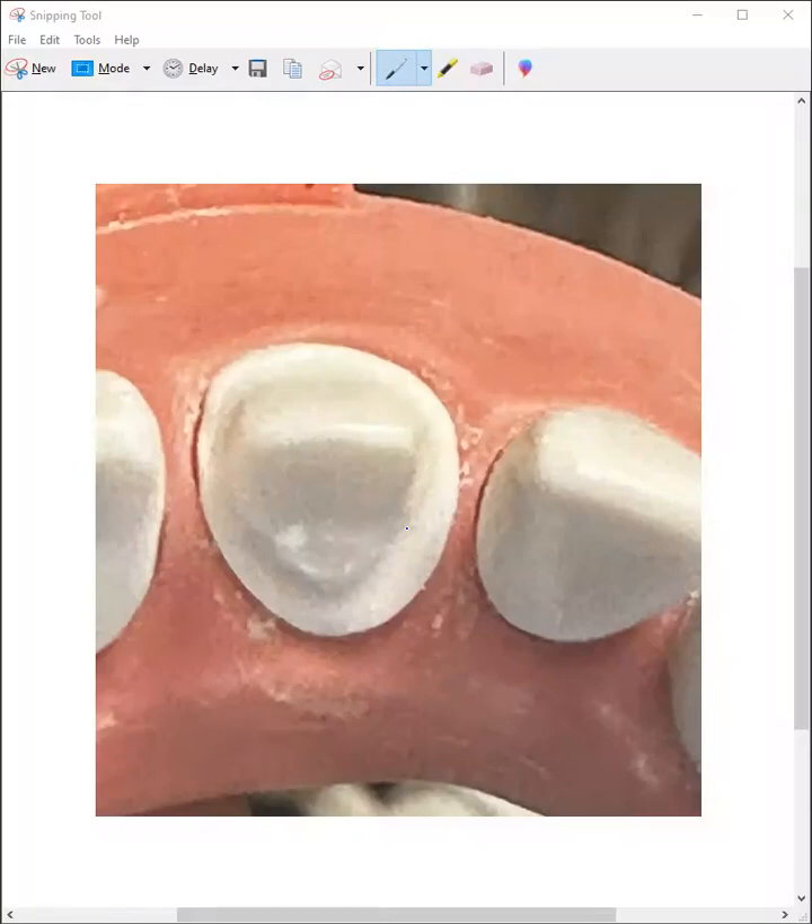Okay, looking at it from the incisal view, I believe you got beautiful margins, continuous. Here you might be a little bit overextended — I think you already know that. This is the tricky part because you have to get through the contact and then mix it all together. So you might get one sub for this, but overall this prep is really good, doctor.